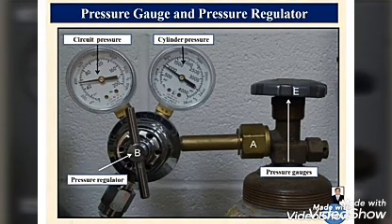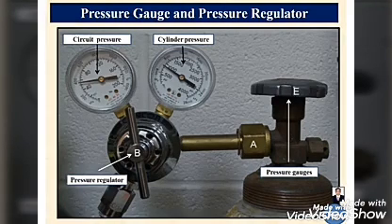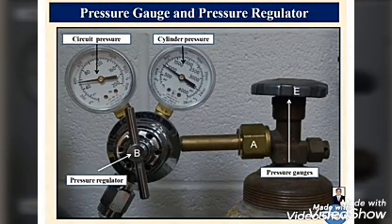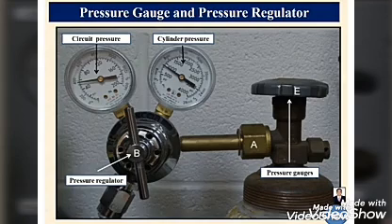So with the help of this second dial, we fix it. It indicates on the gauge, fixed at 40 to 50 psi. And in the Indian measuring unit, it is generally fixed between 3.5 and 4 kg per cm square. High pressure gas within the cylinder is dangerous to the patient. It ruptures the lung tissue. So regulate it properly with the help of the pressure regulator.